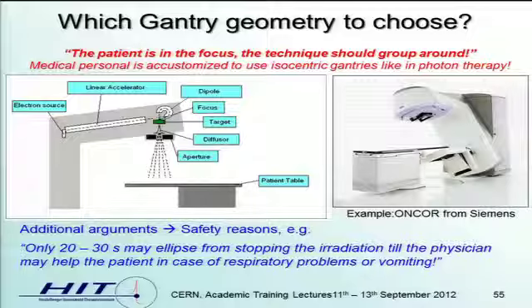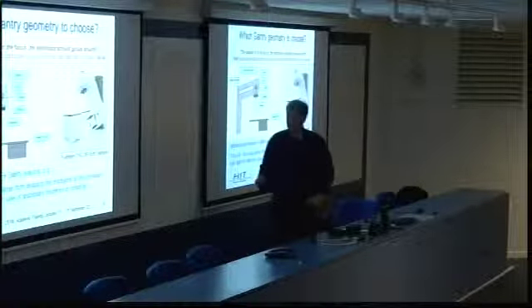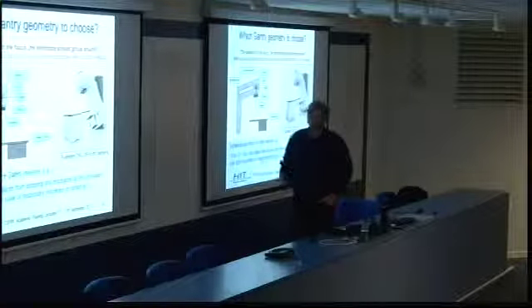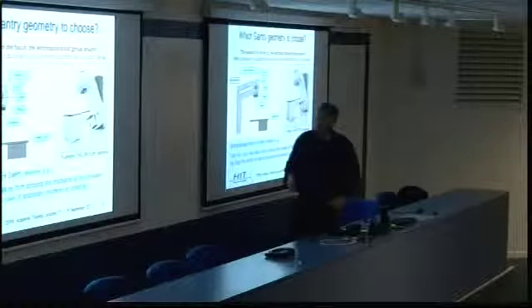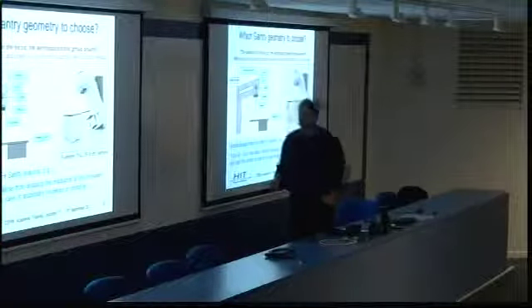Medical personnel are used to these isocentric gantries from photon therapy. I showed this picture yesterday. So they said no eccentric version again. And this is just a feeling from the medical persons. Clearly, they have experience. Well, they are the customers. We have to fulfill their wishes.